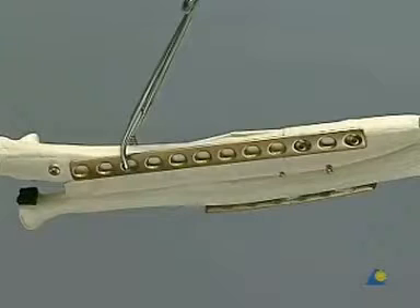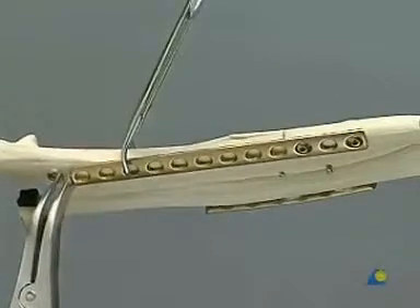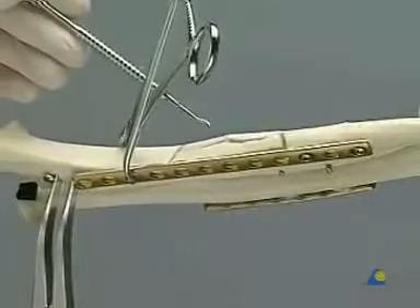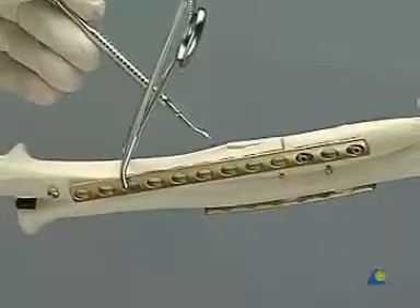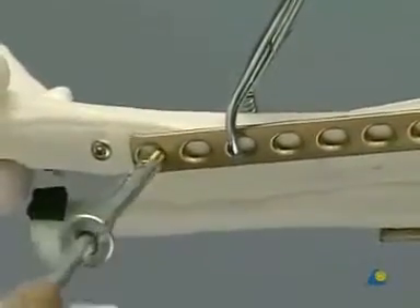To reduce and fix the ulnar fracture, it is first spanned by a 12-hole LC-DCP fixed by two screws inserted in the proximal main fragment, well clear of the fracture. The plate is loosely clamped to the bone and a further 3.5 mm screw is placed 1 cm distal to it. The bone spreader is used to exert traction on the distal main fragment. The fracture fragments are teased into position with the sharp hook. Attachment of the plate to the ulna is completed, usually with three screws in each main fragment.